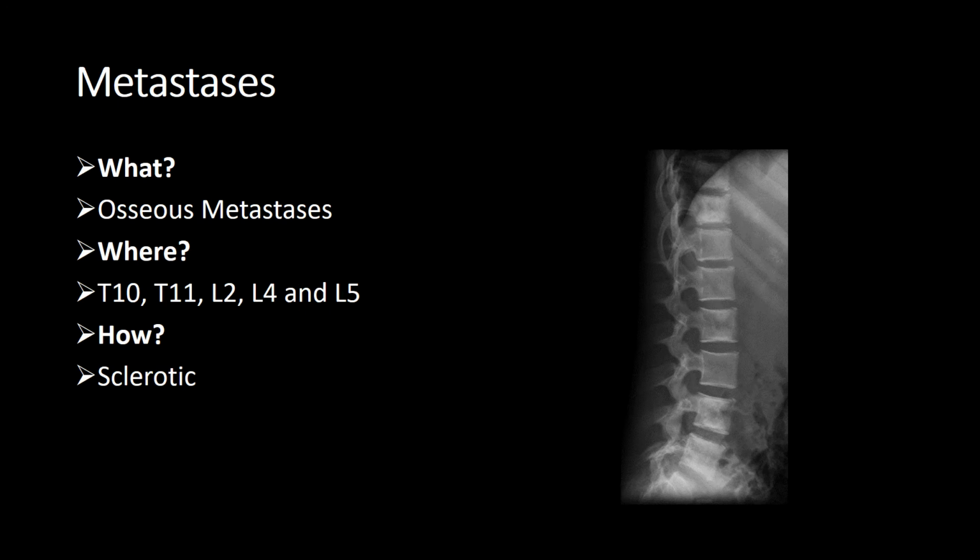Now, osseous metastases, like multiple myeloma, have a predilection for the flat bones and for the axial skeleton. So basically your skull vault, your spinal column, your pelvis, and as I say, your proximal femur and so on. Osseous metastases can either be lytic, and classically lung and breast can be lytic, as can renal.